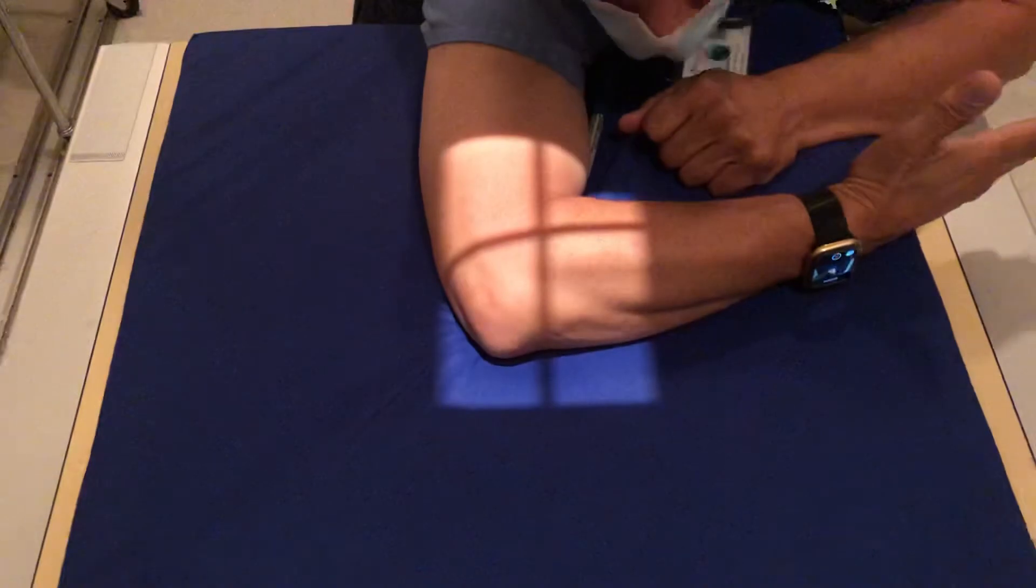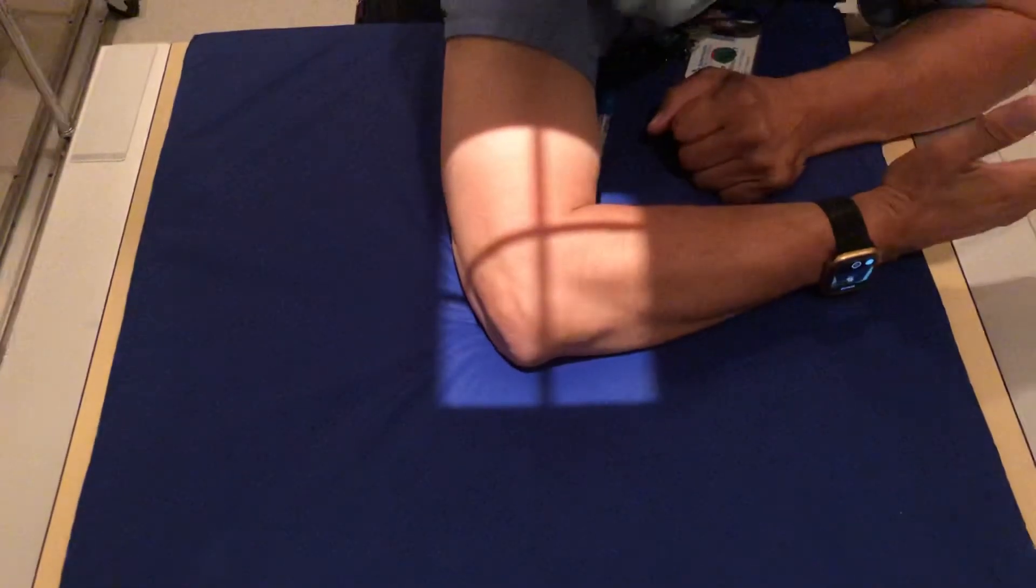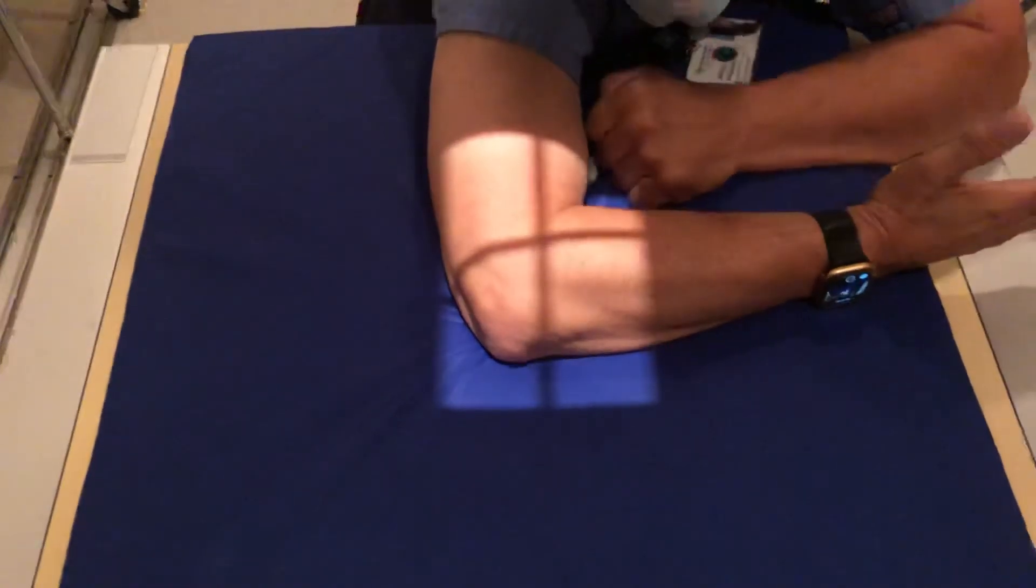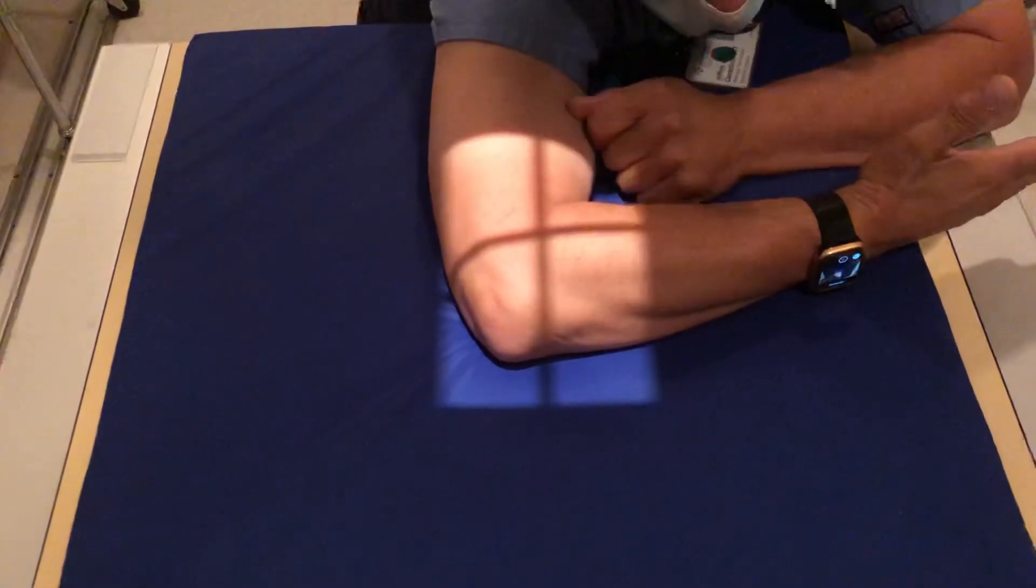Thumb up in the air, just like on the forearm exam, and you're going to shoot right here in the middle of the elbow, try to get in that joint, and bang, got it.